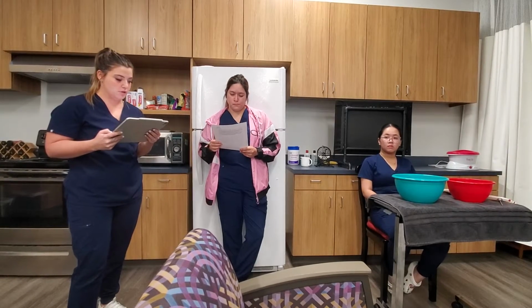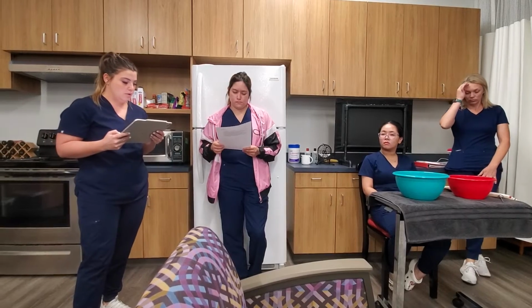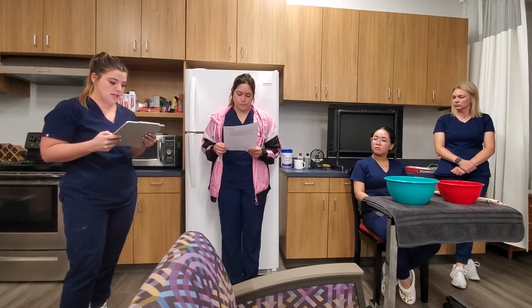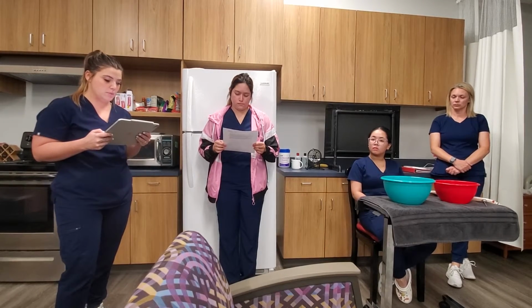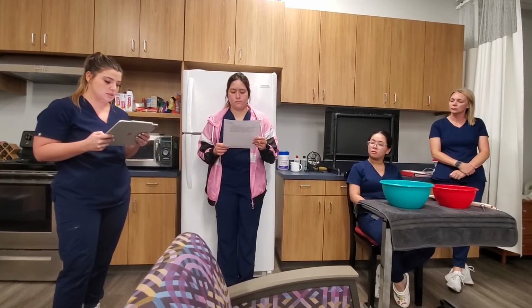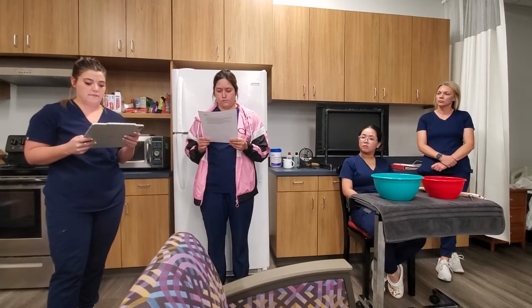Contrast baths are also the treatment method of choice for complex regional pain syndrome, also known as reflex sympathetic dystrophy. When utilizing contrast baths for a patient, it is essential the practitioner begins the process correctly. If the patient has edema in the affected area, then you would begin with the cold bath and end with the cold bath. When the patient is experiencing pain or stiffness, you would begin with the hot bath and end with the hot bath. When the patient initially inserts the affected area into the cold bath, they will feel a cooling sensation, but for the hot bath, the patient will feel a warming sensation.